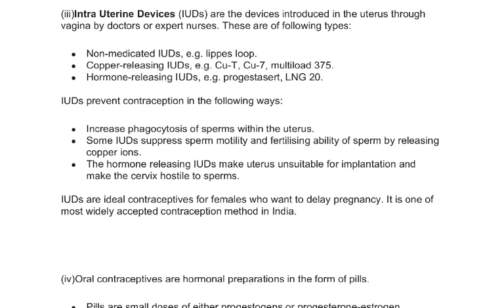Good morning, students. In the previous lecture, we have already seen two different methods of contraception. One was a natural method, the other was a barrier method. In this lecture, we will learn about the third method, that is intrauterine devices.